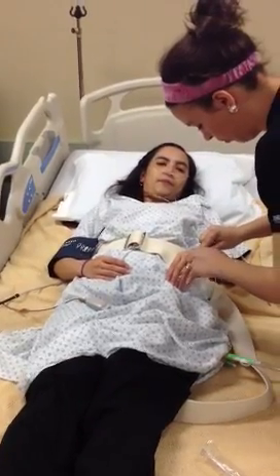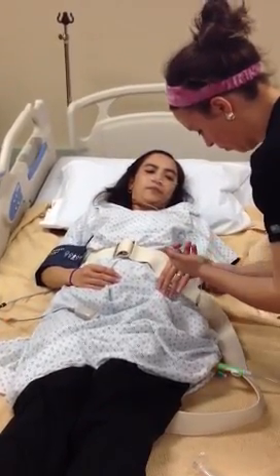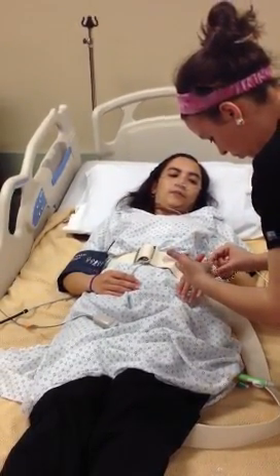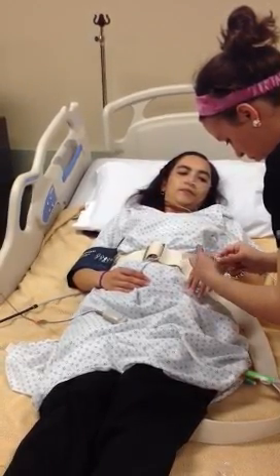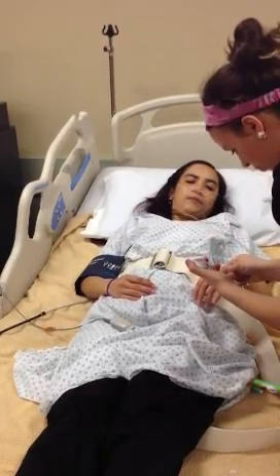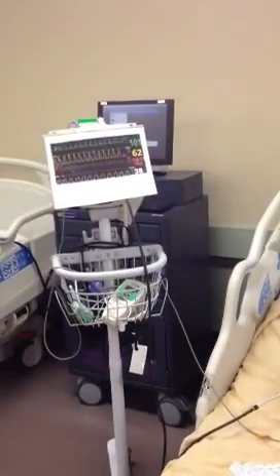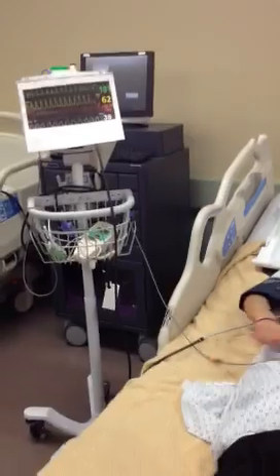This will help limit the amount of tethers so that you won't have to wheel your IV with you. And you can also disconnect them from vital signs monitors while you are ambulating them.